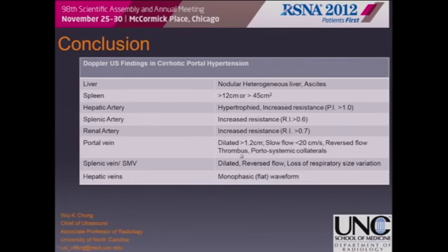Additionally, there's an increased incidence of portal vein thrombosis and the development of portosystemic collaterals in the form of varices.